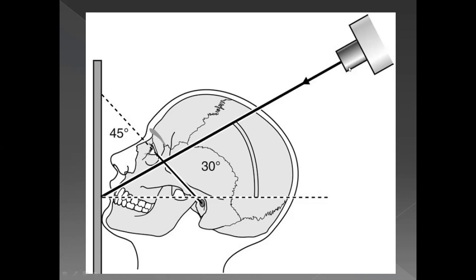But now that you have taken the X-ray beam cranially, it has gone upwards. So it is making a 30-degree angle over here. And what line is this? Well, this is passing between the superior border of the external auditory meatus. It is following almost the sigmoid notch, and it is passing occlusally. All right. So it makes almost a 30-degree angle with this line. So this is why this is called a 30-degree OM view.